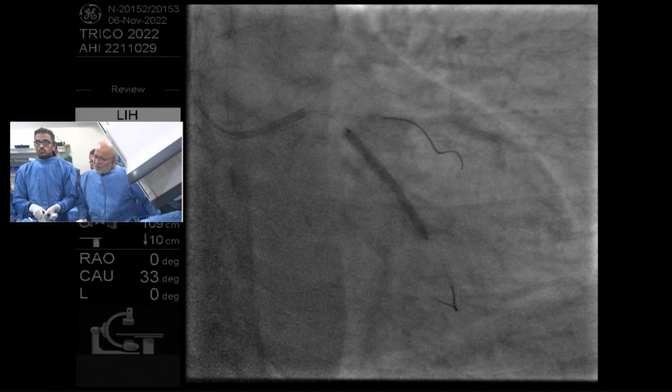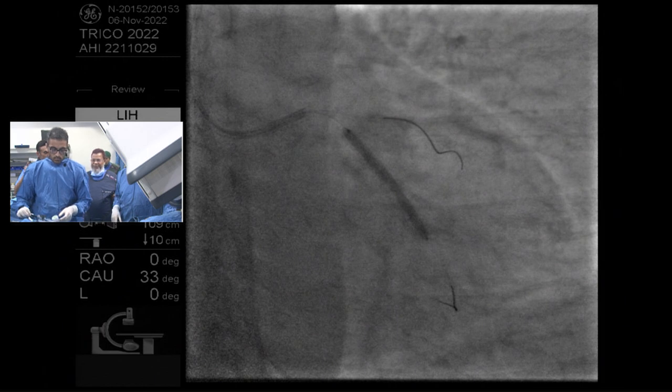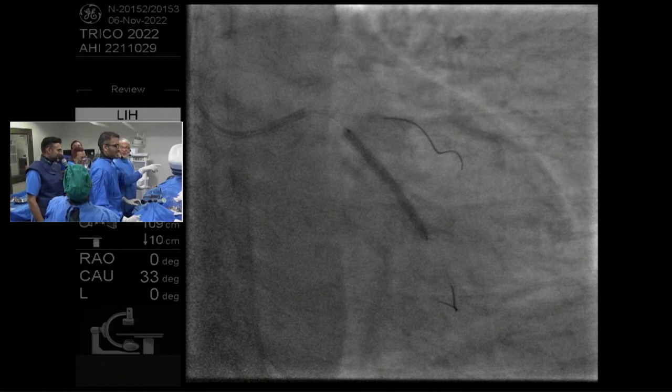To me it looks like, the way it has expanded, if you do IVUS, it will look perfect. Yeah, if you want to IVUS it before post-dilating and you can prove there's no need, that's fine. What is your take? My concern is that proximally the vessel is large enough that you need a 3-0 proximally. But somehow my old eye feels that it has expanded very well. My new IVUS eye says that you need a bigger stent proximally. What is the panel's take?